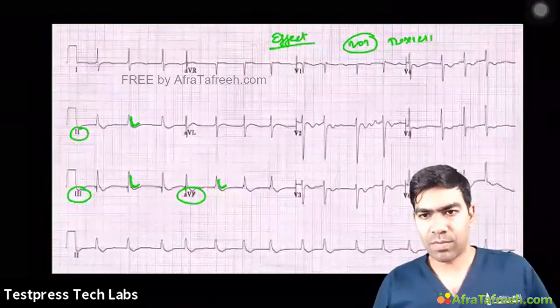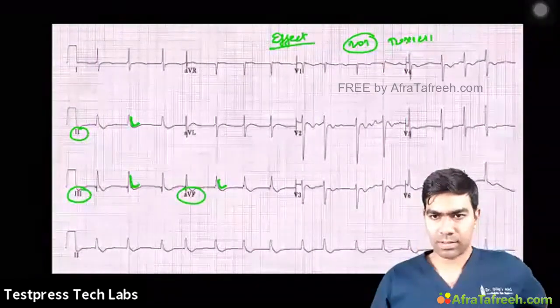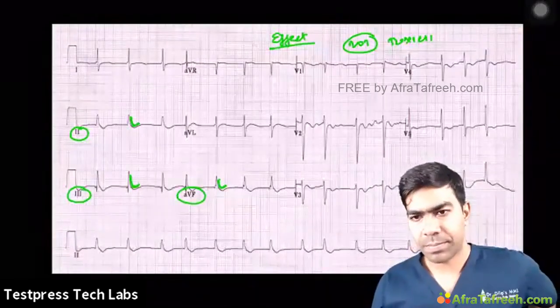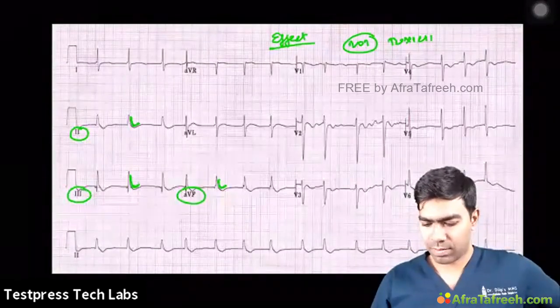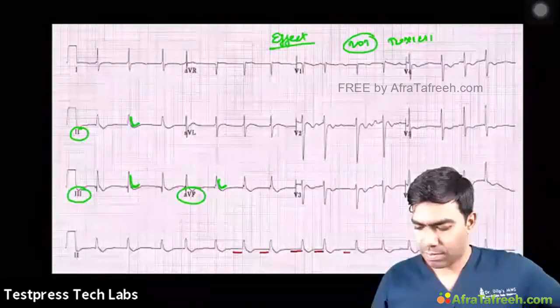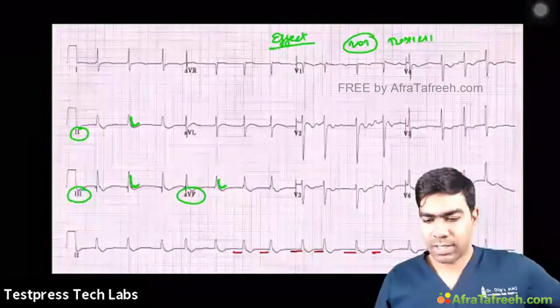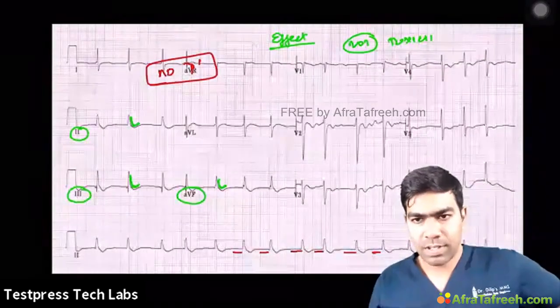Anyone found the P wave in this ECG? Yes, where is the P wave? Show me. I couldn't find it. Where is the P wave? I don't think this ECG is having a P wave. So there is no P wave in this ECG.